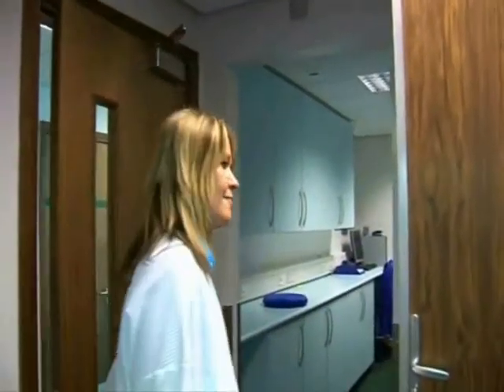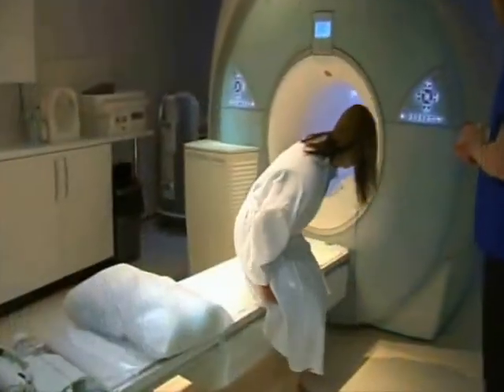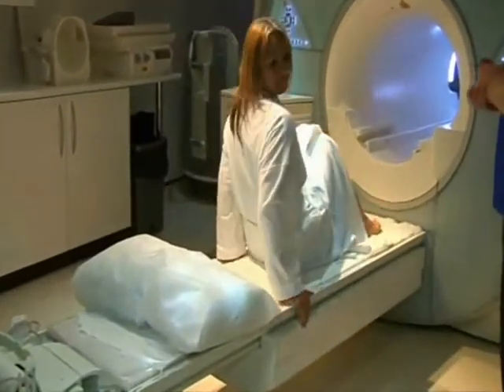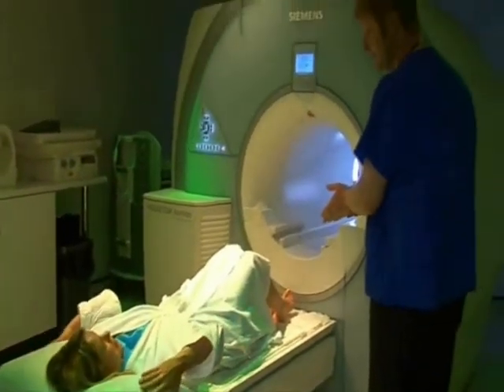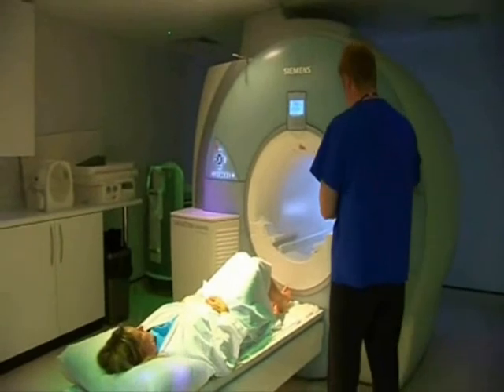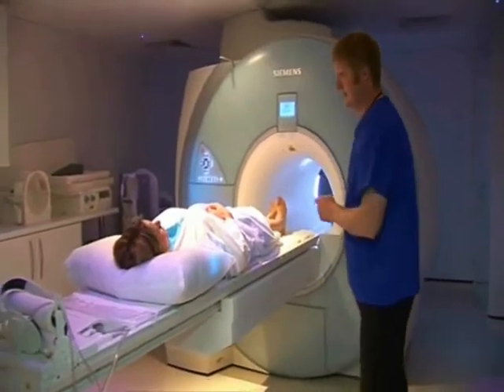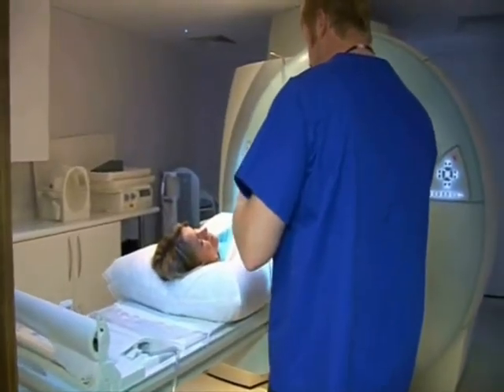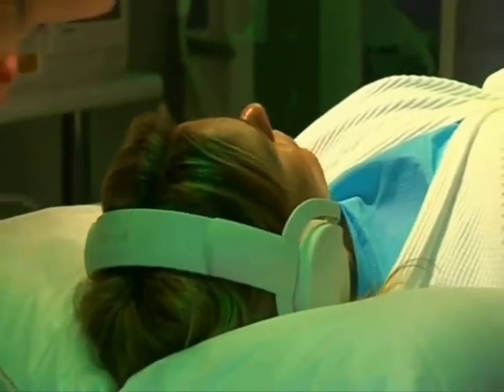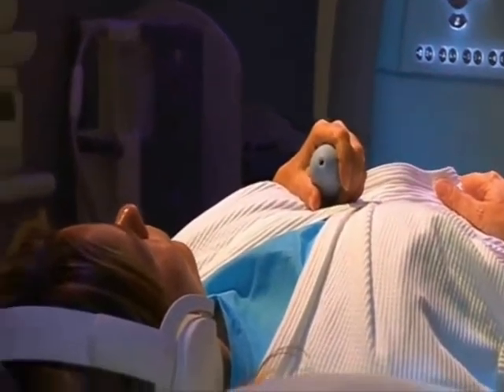Prior to the start of your MRI exam, the technologist will explain the procedure to you and address any concerns you may have. Once inside the MRI room, you'll be asked to lie on your back. The table will then rise. Because the machine is noisy, you'll be given some hearing protection, in this case earplugs or a headset. You will be given a call bell just in case you need to stop the testing or need to talk to the technologist.